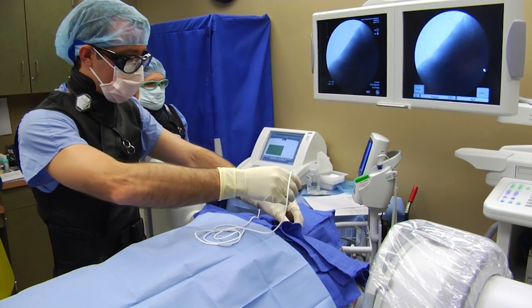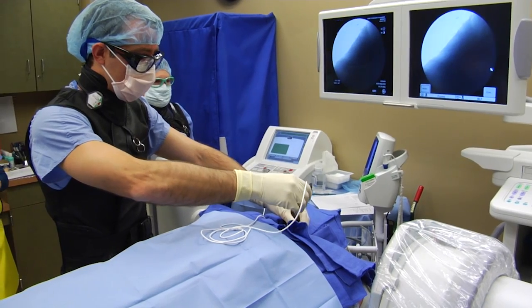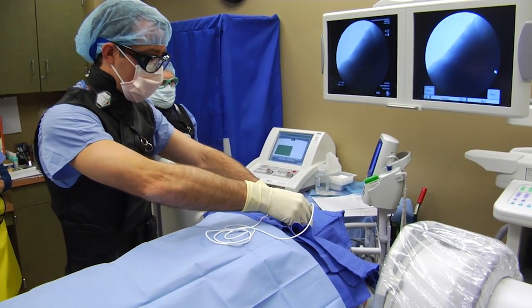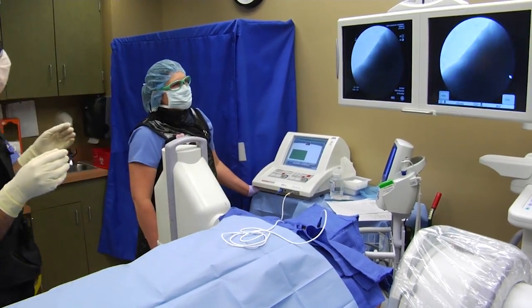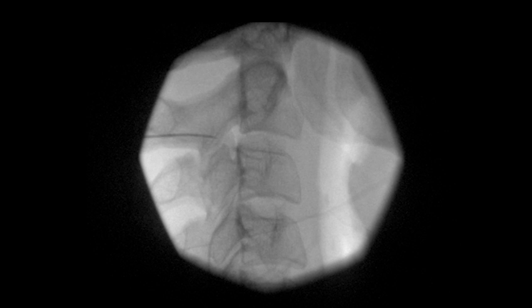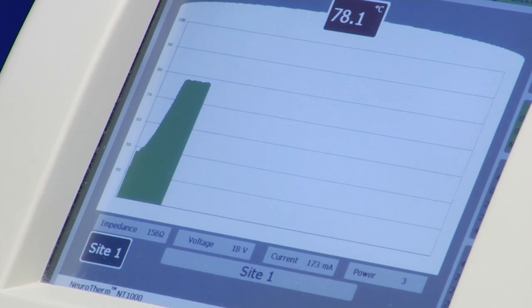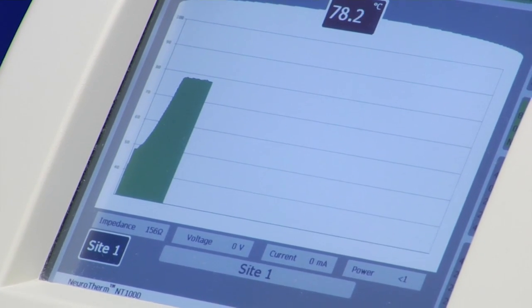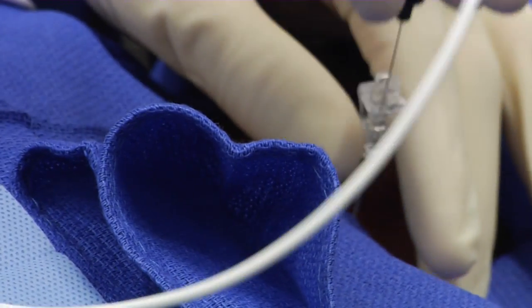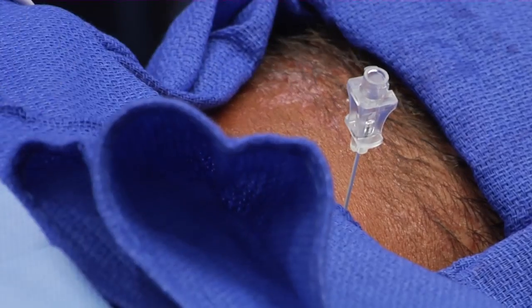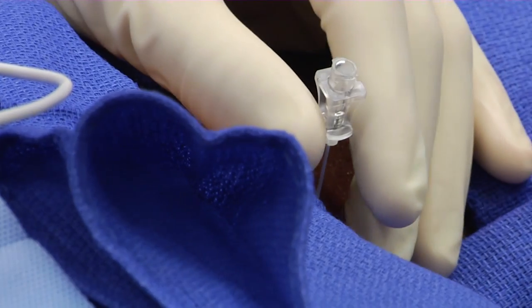Prior to each radiofrequency lesion, a fluoroscopic lateral view shows the needle tip remaining in the same testing position and posterior to the neuroforamen. At this point, I remove the inner cannula and insert the trocar back into the needle.